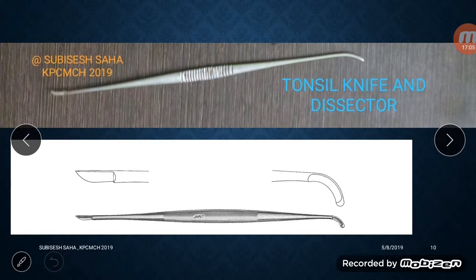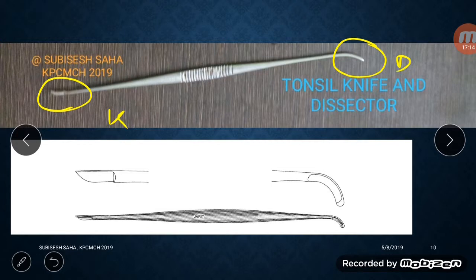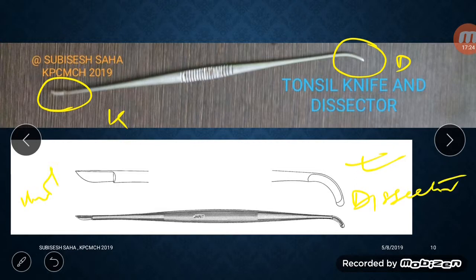The next instrument is the tonsil dissector and knife. One end is the knife and the other is the dissector. The knife cuts the tonsillar end, and the dissector is used to pull the tonsil.